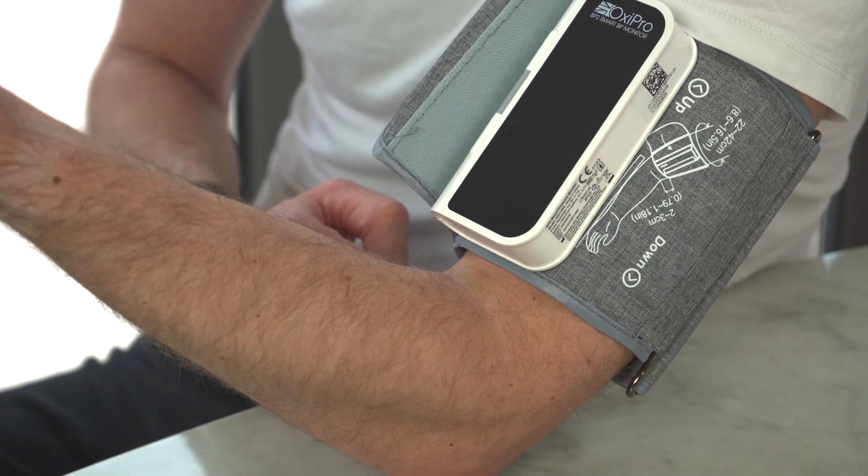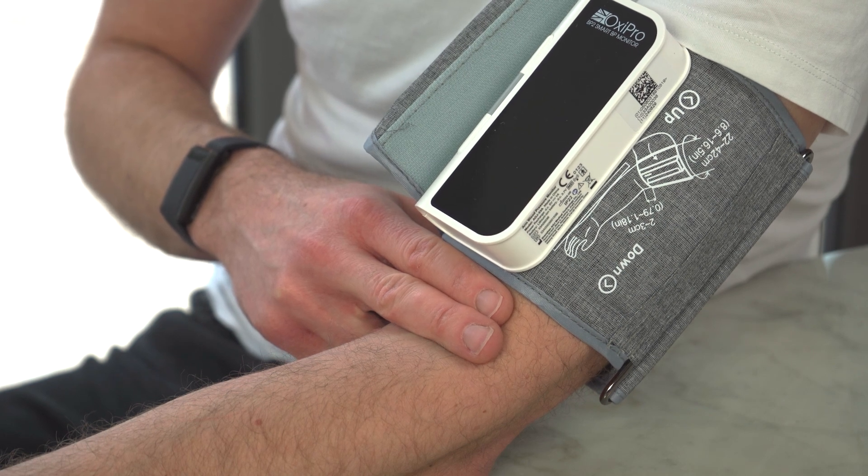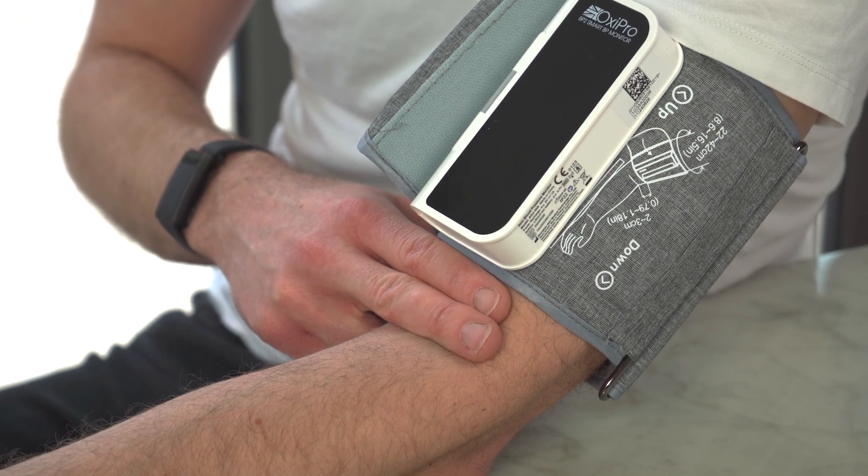Position the cuff around two finger widths up from the inside of your elbow joint, making note to align the cuff according to its markings with the main artery on the inside of your arm.